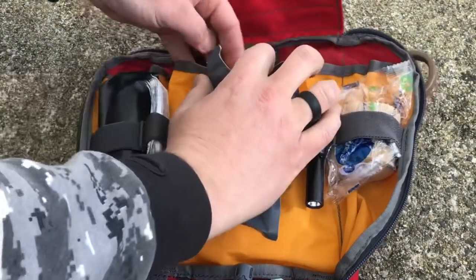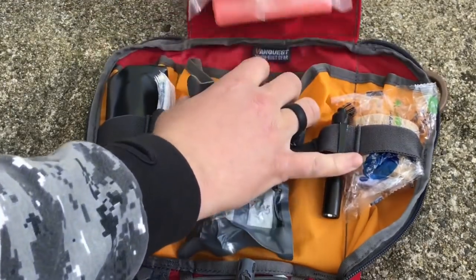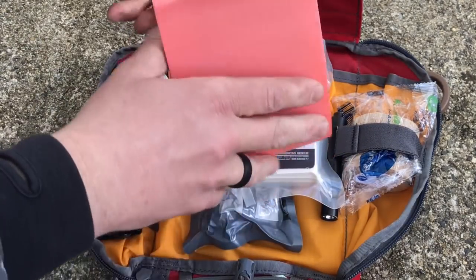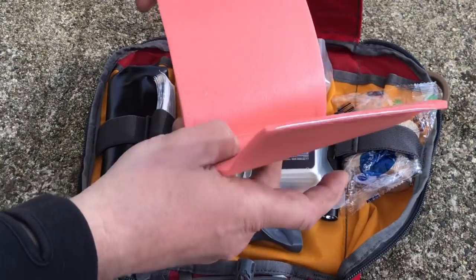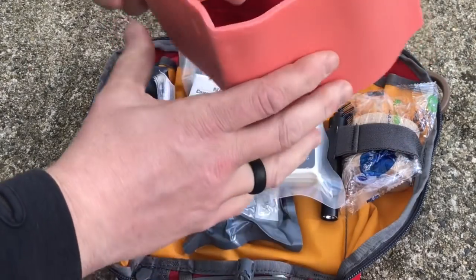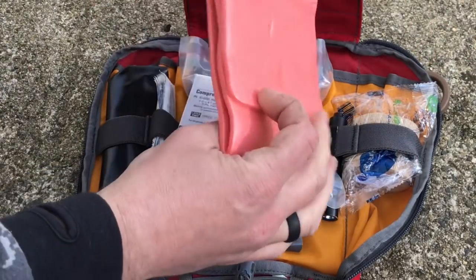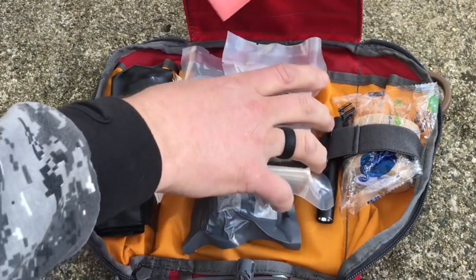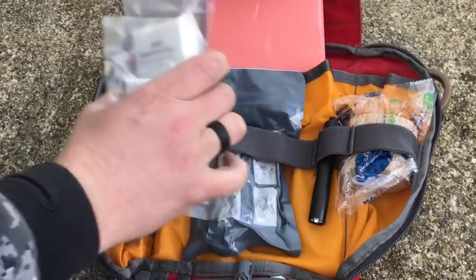Back in here, in this back section, I've got some compressed gauze. And then I've got a splint — it's soft on the outside but has a harder material on the inside. I'll put this around an arm, a leg, whatever it might be, to give it a little bit more stability. That's everything in this top section.